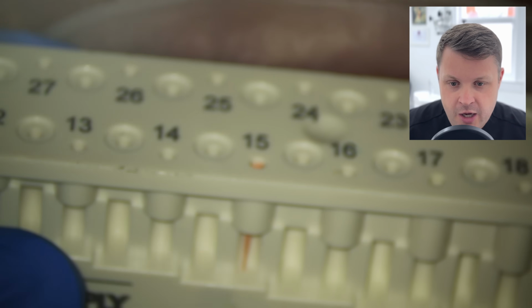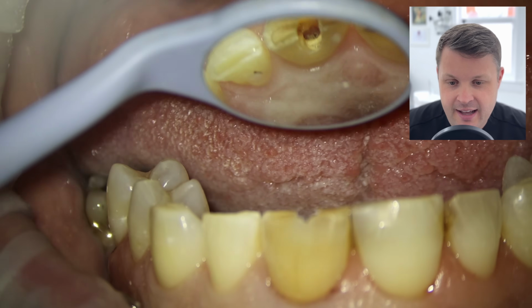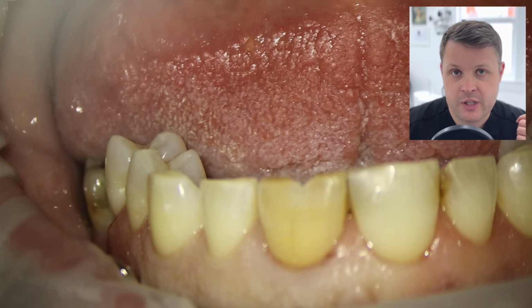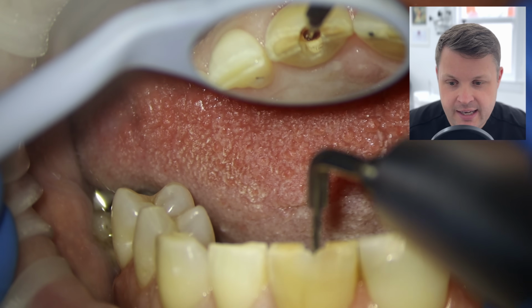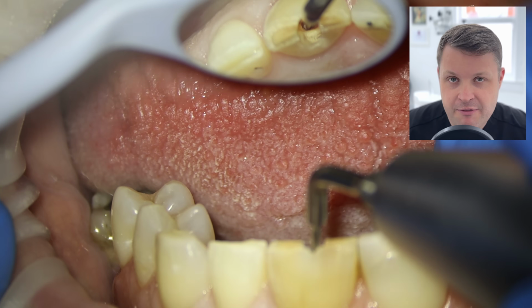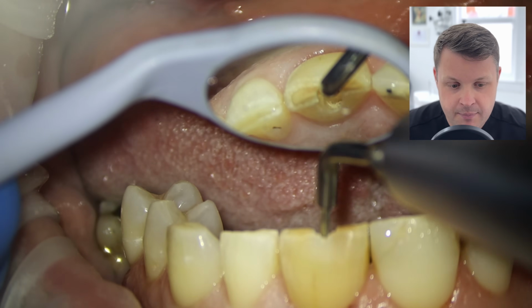And again, there's a massive argument to say that we should be taking a CBCT scan. But when I pull the GP cone out, I can see that I'm about 15-16 millimeters. And again, that to me should have been a red flag that I was perforating the tooth, because we know with the cone beam CT scan that it's about 12 millimeters from that orifice. And then I'm going to do a bit more deeper instrumentation, because I feel like I am in the correct orientation, remember, even though I am not.